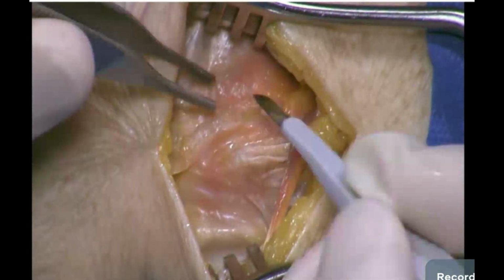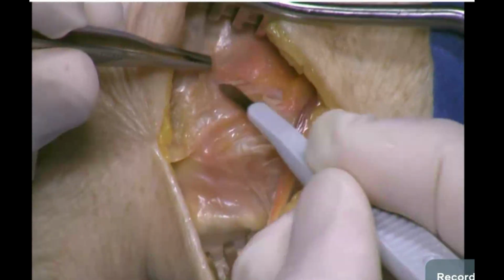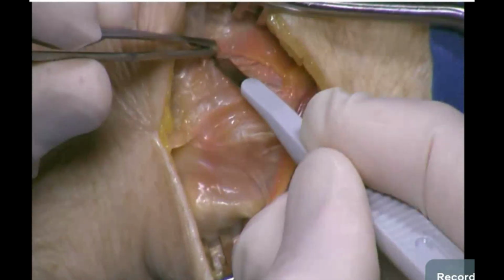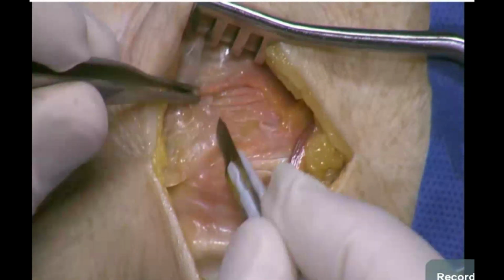And periosteum on both these sides is useful, especially ulnarly. So I will elevate off of the fracture site out distally, trying to preserve any tissue I can to sew into. That'll be helpful during the retinacular closure later. And then the joint line can be felt.